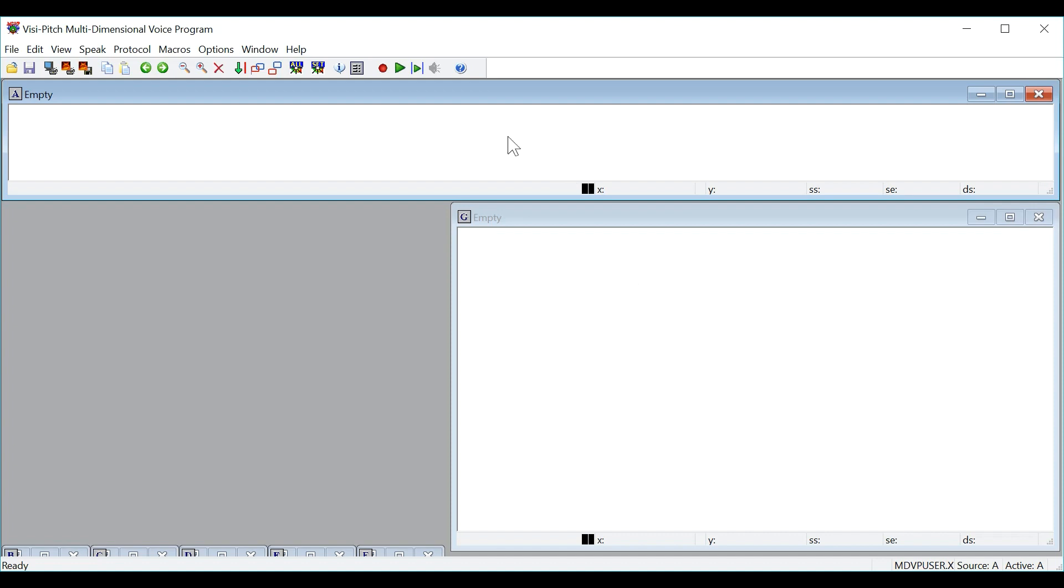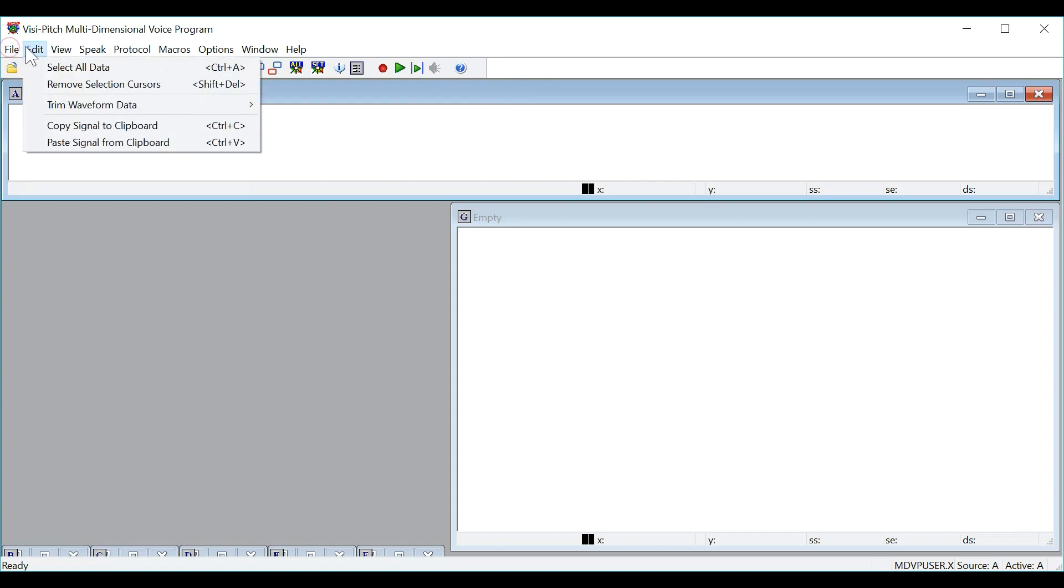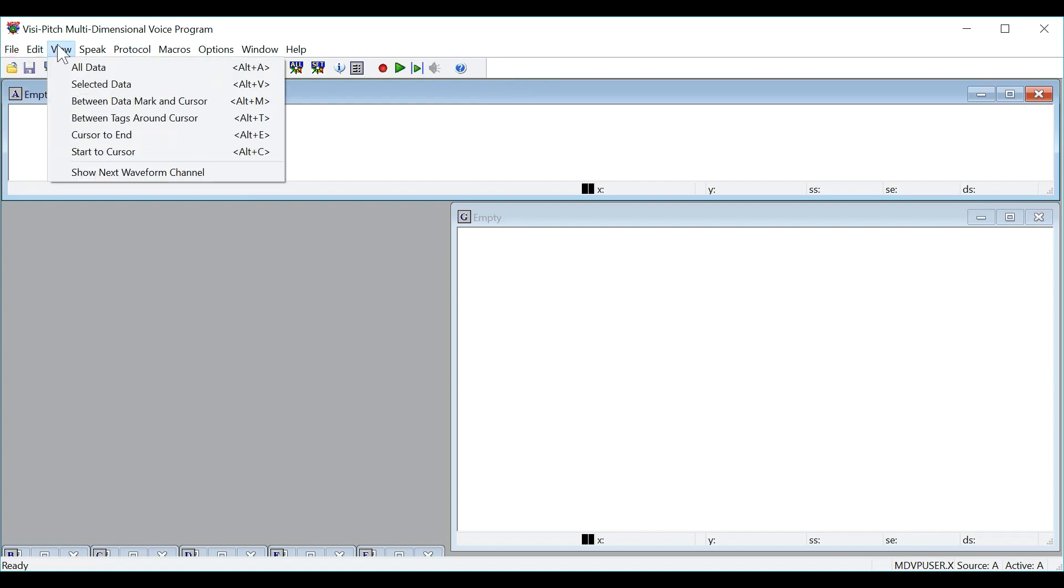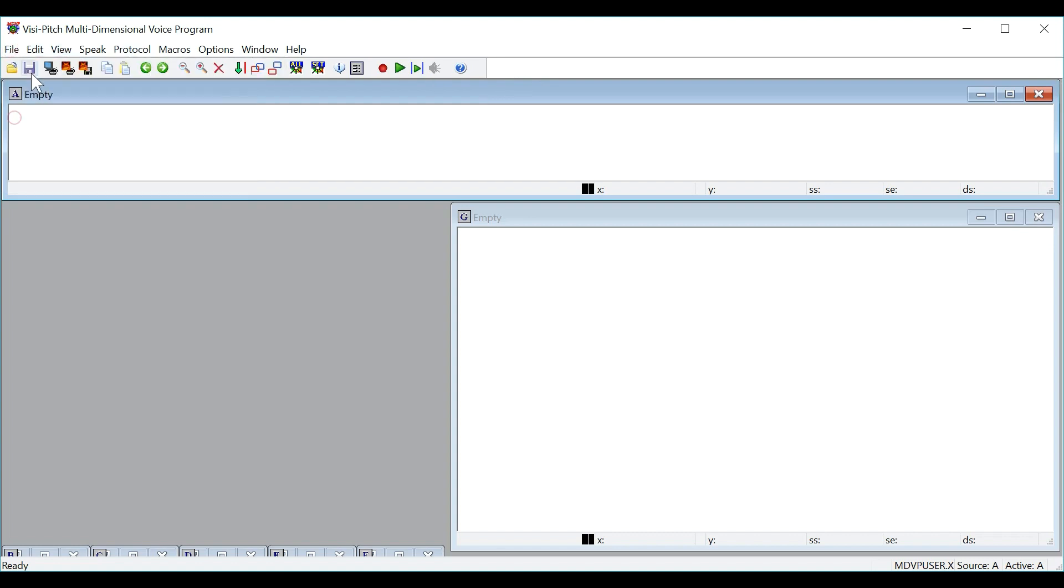When you first open the program, this is the window you will see. At the top left, you will have pull down menu buttons, and directly below, you will have a toolbar with many commonly used functions in the program.